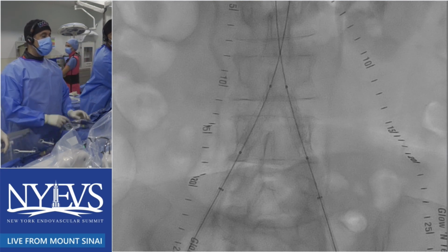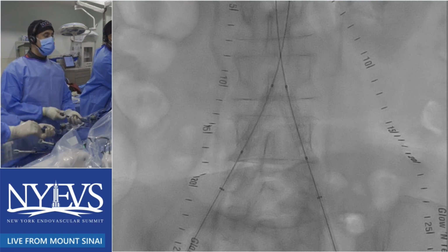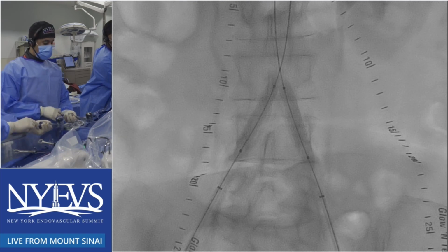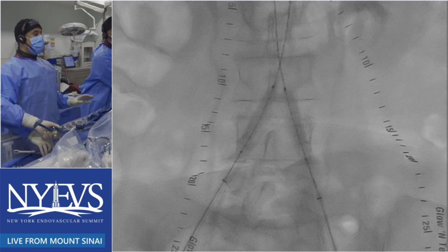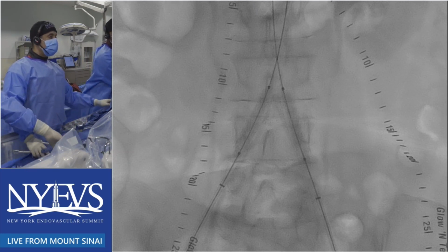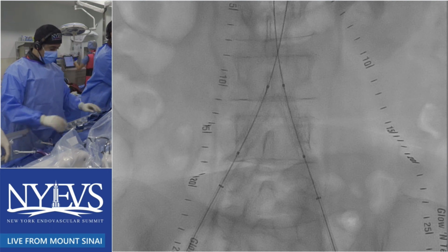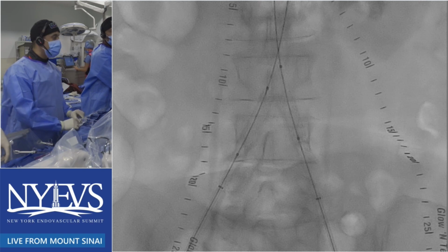Go up again. Go up again, guys. Yeah, it's okay. Go up again. Pressure. And sometimes what I'll do is I'll take these balloons up a little bit and just dilate them to make sure that I'm getting adequate expansion of that distal aorta. Yeah, I do the same thing. So after this inflation, the post-dilatation, you just go up a few millimeters in the aorta and do another inflation as well.